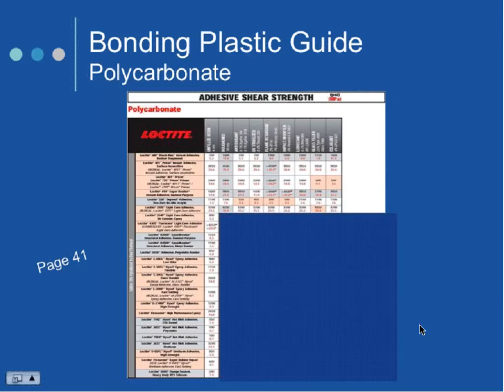So if you just go down here, you get a sense of some of the adhesives that we tested. When you get down to this section where you say, well, why didn't they test all of these in the same way? These were recently added new products, and it would have been another 2-year project. So we just wanted to get a sense of what it looked like on the unfilled resin, okay? That's the reason you'll see it that way.